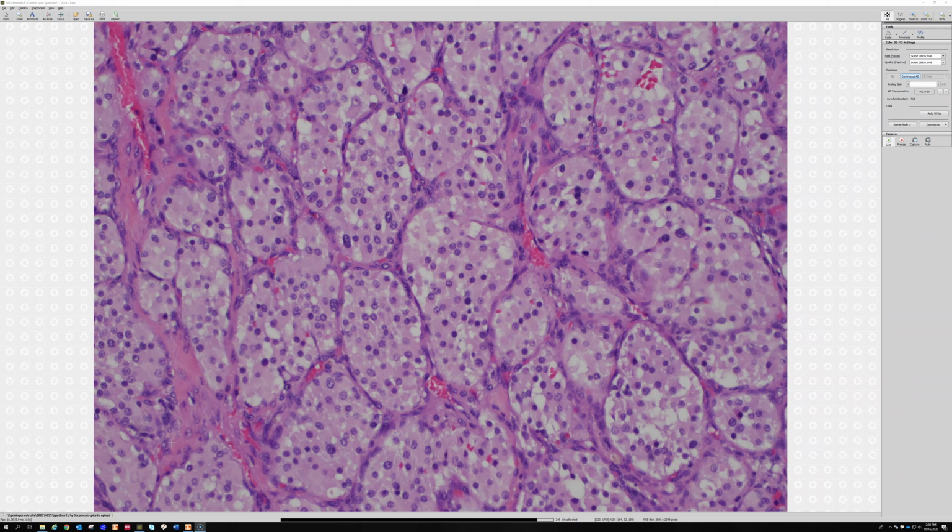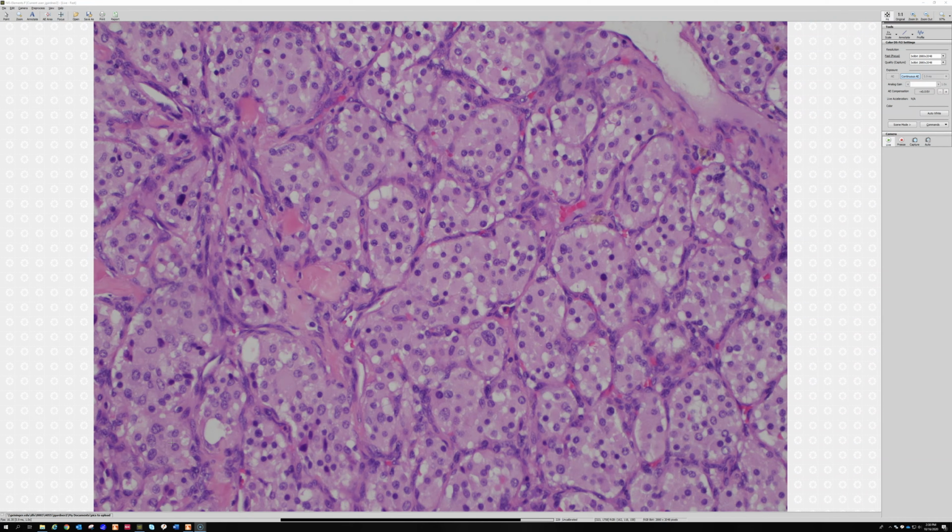Okay, and so some paragangliomas are associated with a syndrome. They have a syndromic association. A lot of those syndromes are related to germline mutations of the SDH, succinate dehydrogenase gene. And also occasionally you can see them in association with neurofibromatosis type 1. So good to know about that subset of paragangliomas and pheochromocytomas are syndromic, and the rest seem to be sporadic. So a good example of paraganglioma and pheochromocytoma would look identical to this, but it'd be in the adrenal medulla.